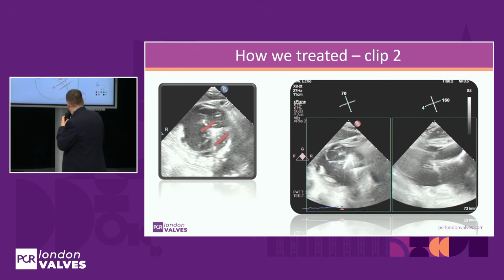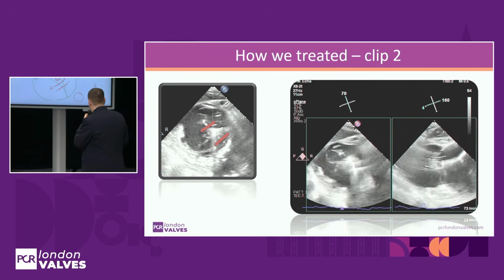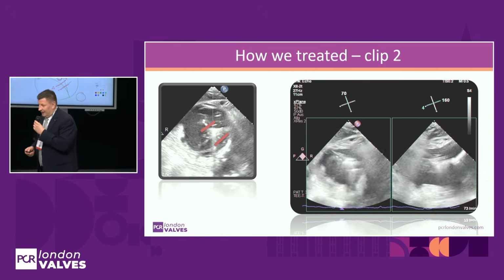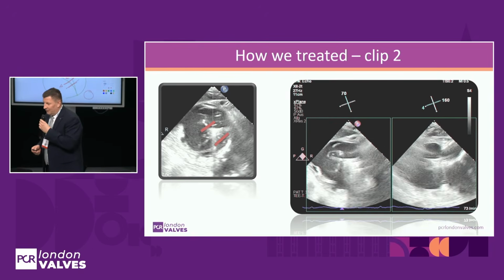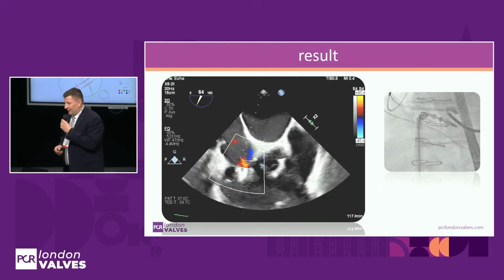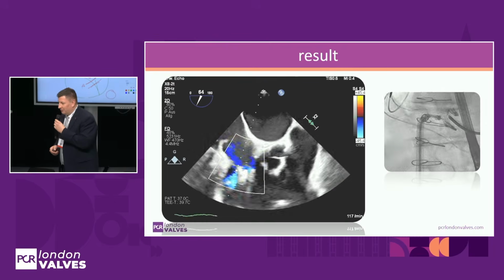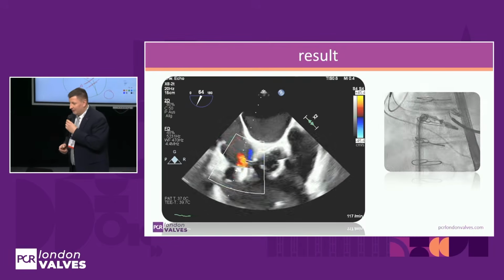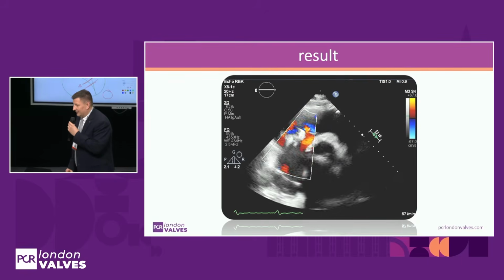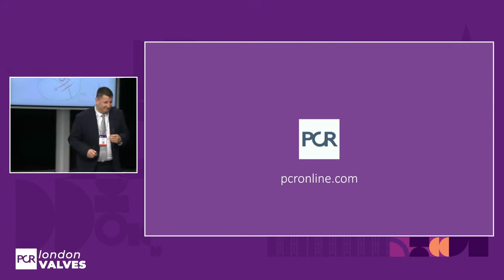And the next grasp is that we want to jail the leaflet. We go septal posterior of the leaflet, of the lead. And I think we can do it also with this lead shadowing from a transgastric way. And this is the final result. You see the ICD lead is jailed between the 2 clips, and also the final result after deployment of the clip is, I think, very good. Congratulations. Thank you.